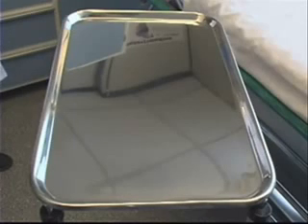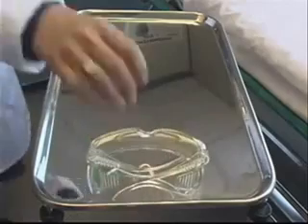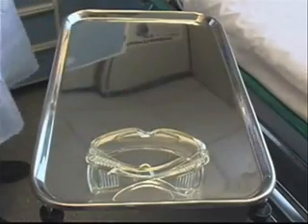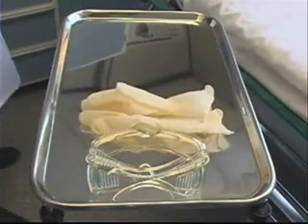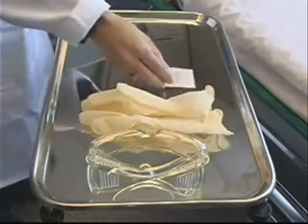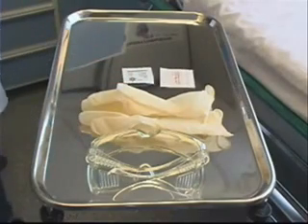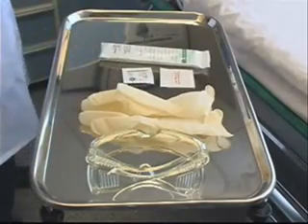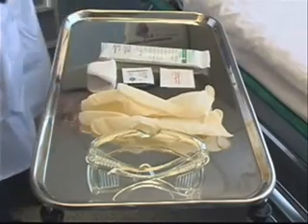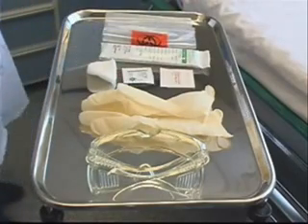The equipment necessary for arterial blood gas sampling is protective eyewear and gloves for universal precautions, povidone-iodine swab followed by an alcohol swab, an arterial blood gas sampling kit, 2x2 gauze, and a bag of ice to put the sample on to send to the lab.